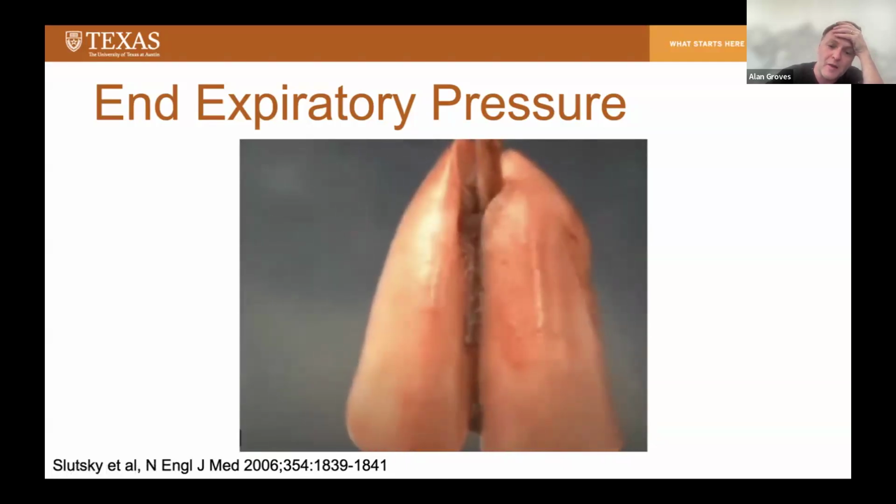And now finally on that breath, we've gotten to full lung recruitment. And I really encourage people to think about what we're doing on our babies as lung recruitment measures, because when we talk about increasing the CPAP, that's probably what we're talking about. When we talk about increasing the PEEP on the ventilator, that's probably what we're talking about.